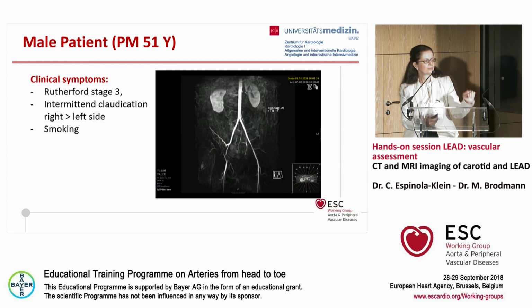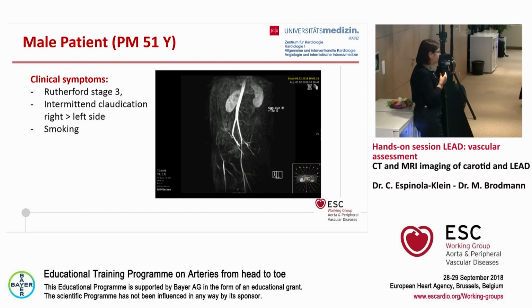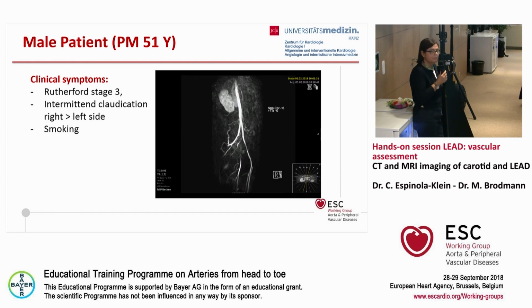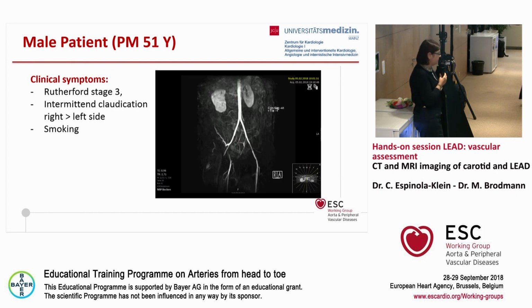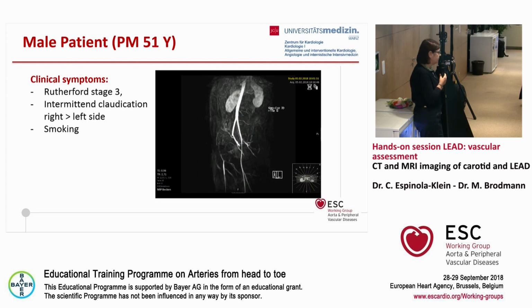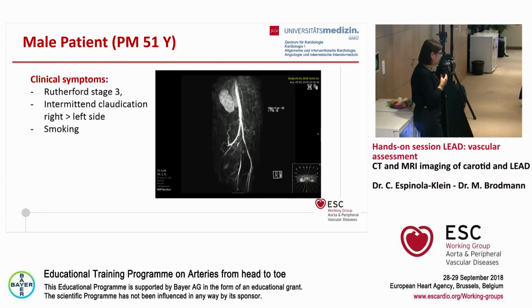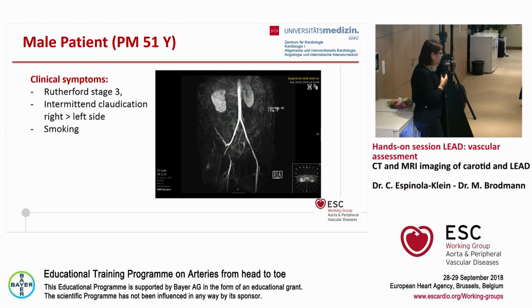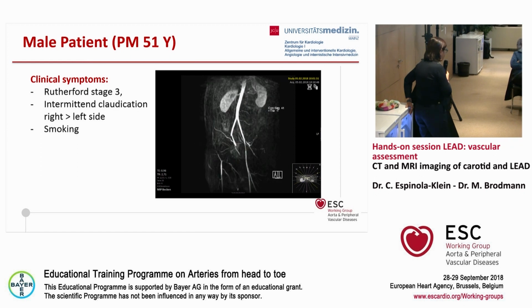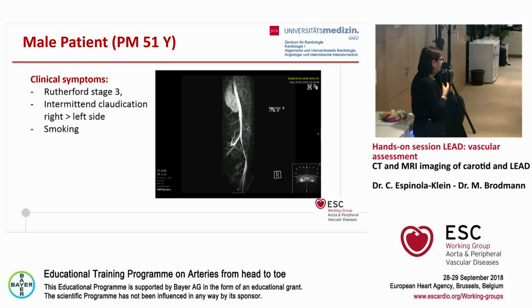What's the problem? Would you leave it with this kind of image, or say, okay, I need a CT scan for that? This is a patient, 51 years old, so he is showing up for the first time. Whether we do some kind of treatment or just exercise training, he will show up once and once again. If you are too aggressive with this high-radiation imaging like CT scans, I think we do not do any good to this kind of patient.